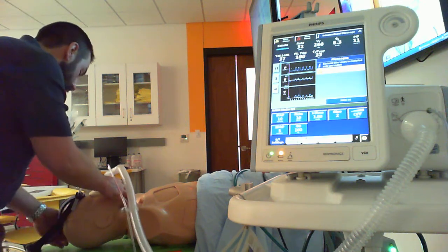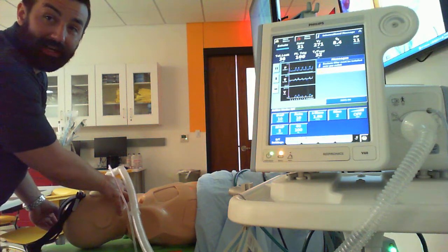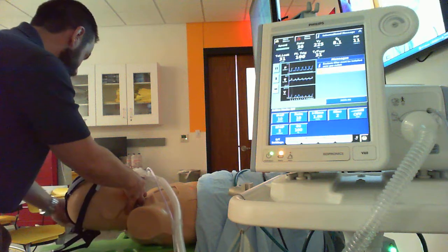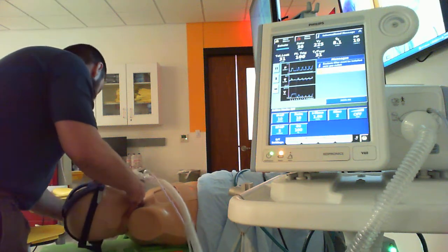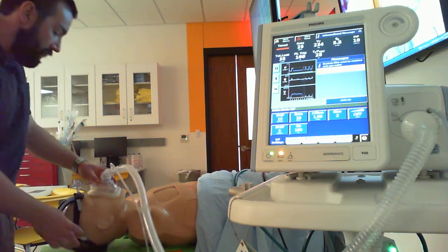All right, buddy. So I have those straps all nice and loose here. I would have this patient in an upright setting. I can't do it with the ASL 5000 here. That just makes it a little bit easier for them to breathe while we're doing this. It also makes it easier for application. I want to make sure my straps are not all twisted.